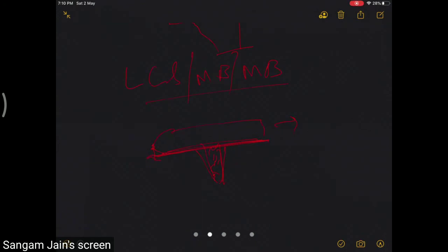The other thing is, if you have some amount of malpositioning of the components, because of this free mobile poly, it aligns itself to the femoral component, irrespective of the base plate anchorage to the bone.